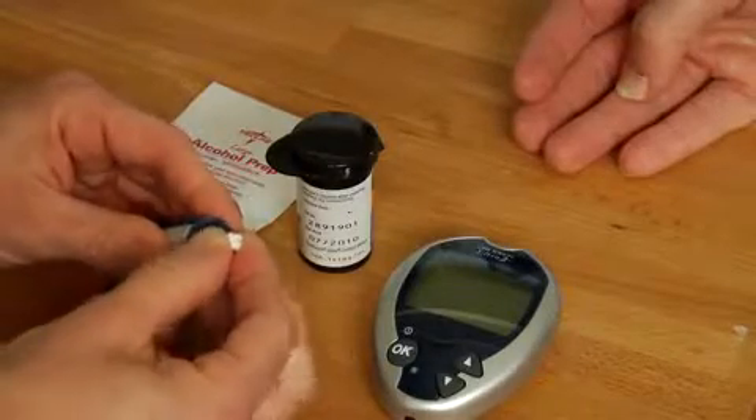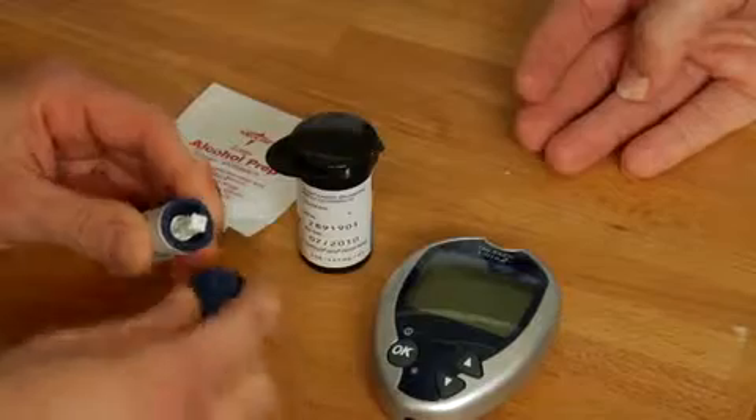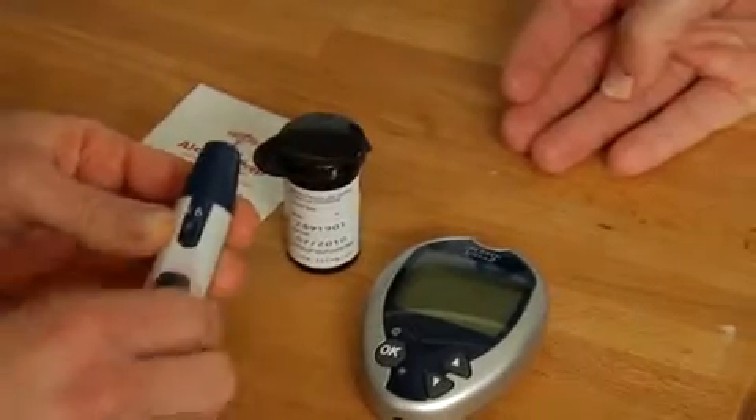You're going to take the lancet, which has the needle in it, and insert it into the plunger. You're going to adjust the height to what you prefer — the depth that the needle is going to hit your skin, piercing the skin and drawing the blood.